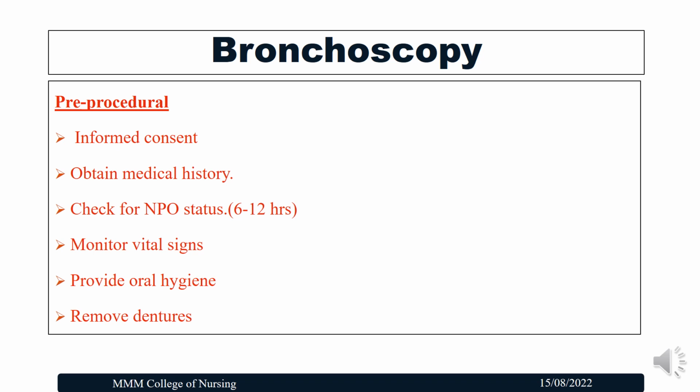Then monitor the vital signs thoroughly, provide oral hygiene, and remove any dentures, partial dentures, or removable bridges from the patient. While inserting the bronchoscope, there is a chance of them falling into and obstructing the lower respiratory tract. So we should remove the dentures.